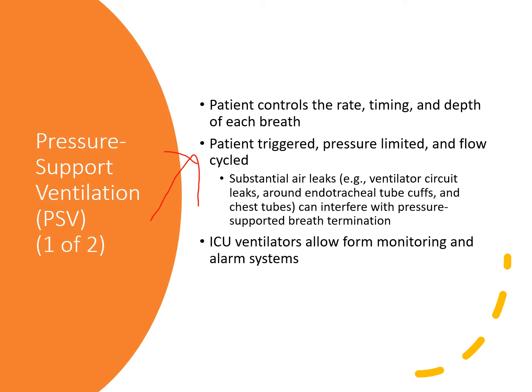So if that doesn't sound appropriate to the care team or to the situation, another approach is to establish the patient's respiratory rate, usually between 15 to 25 breaths per minute, or a tidal volume in adults of 300 to 600 mLs.